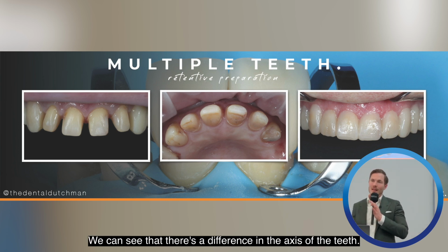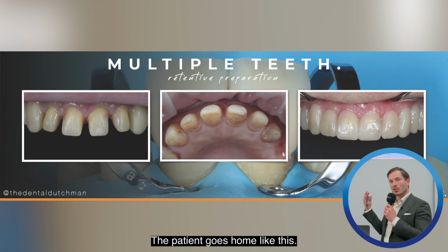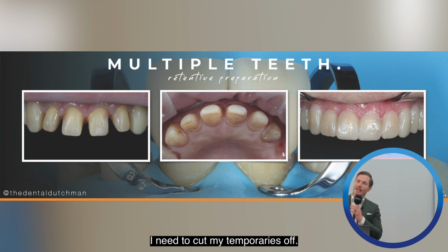We can see that there's a difference in the axis of the teeth, and you can see the provisional restorations on the right side. Patient goes home like this, but when they come back in to place the final restorations, I need to cut my temporaries off. So that's important to know.